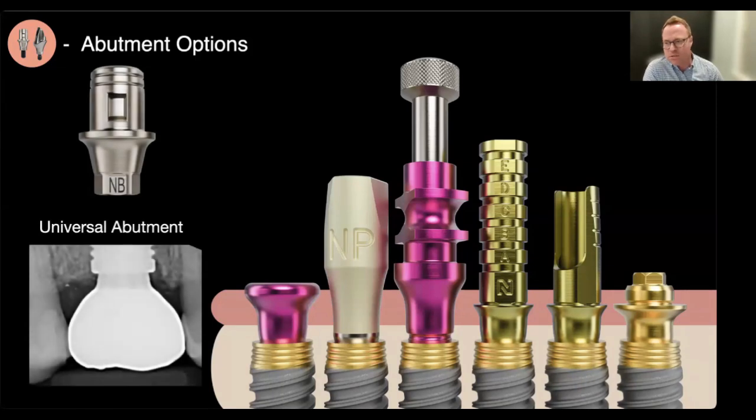So those are some things you'll see coming that allow us to still use a universal stock abutment, but have better emergence profiles. Just something to keep in mind, and you can see again an example of that.